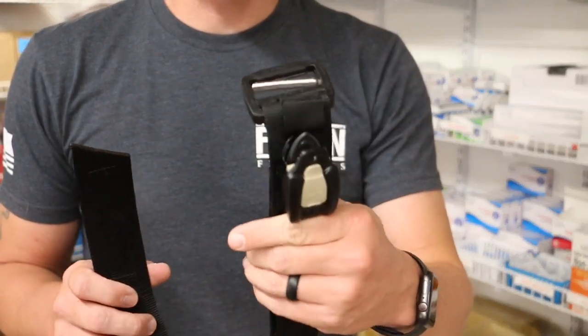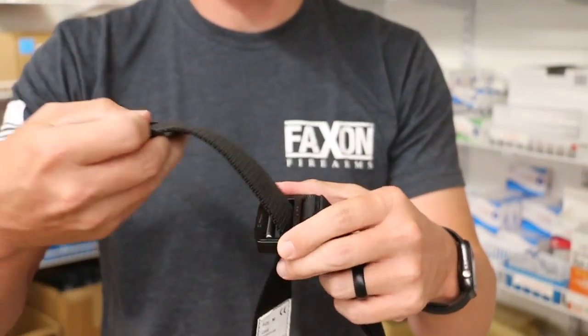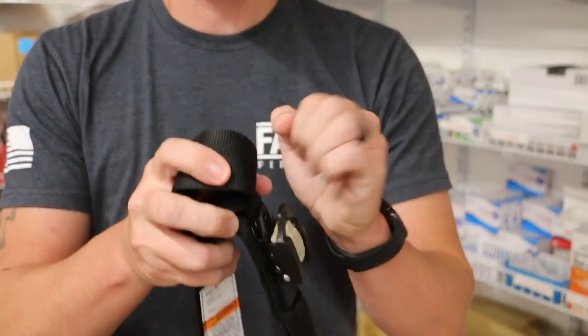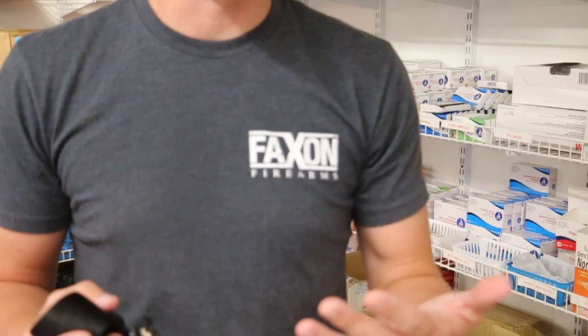I will say that one-handed application is out the door on this. There's no way you can feed it through this buckle and tighten it up on your arm to get it applied. So one-handed application is out the door.